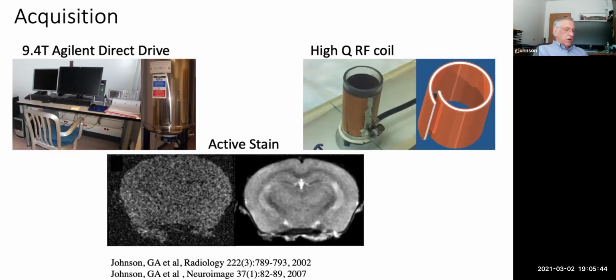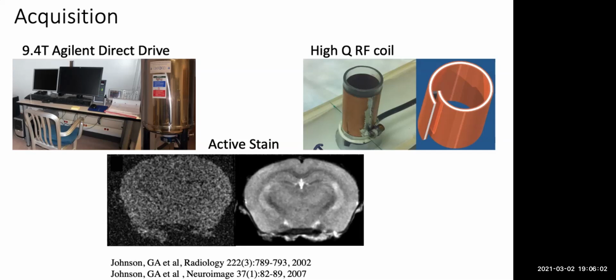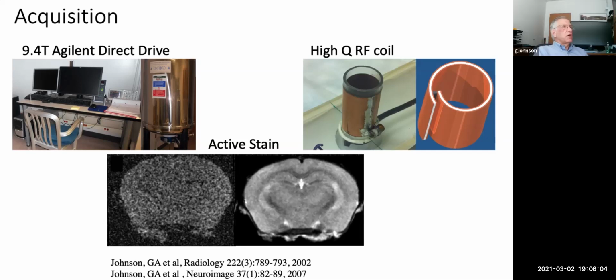The elements that are most important to getting the signal to noise, sensitivity, is sort of like location in real estate. In real estate, the things that people talk about that are most important are location, location, location. And in MR microscopy, the issue is sensitivity. If your voxels are 1,000,000 times smaller than a clinical scan, your signal is a million times weaker. So you have to do some extraordinary things to recover the sensitivity necessary.